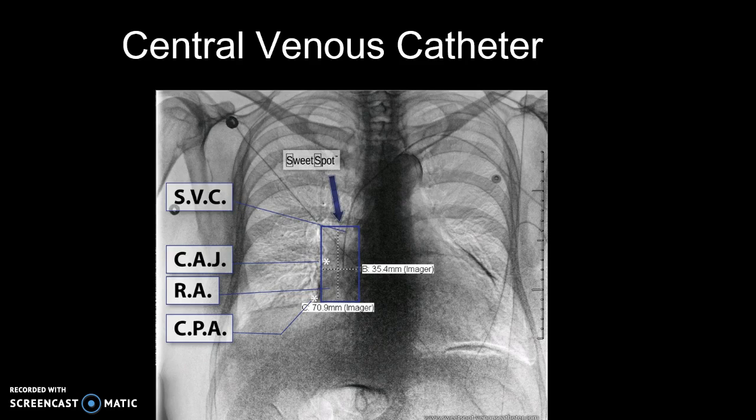A common concern for acute care nurse practitioners is the common question, can I use my line? This is a great breakdown of where you should see your central lines. When in doubt, wait for the radiologist. Remember that when you are working clinically, you will become an expert in your service line, so don't feel overwhelmed right now.